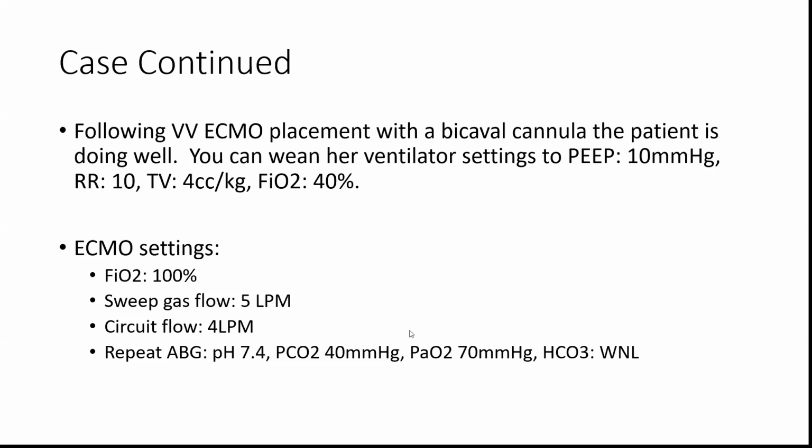Okay, who's happy with this? Or who wants to change something? Dan's happy. Okay, you're happy. Nora's happy. I wanted to set the PEEP on the vent settings. So I want to come down more. You'll drop it a little bit lower.